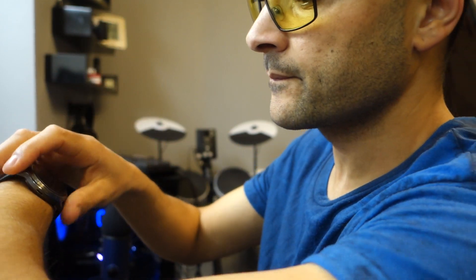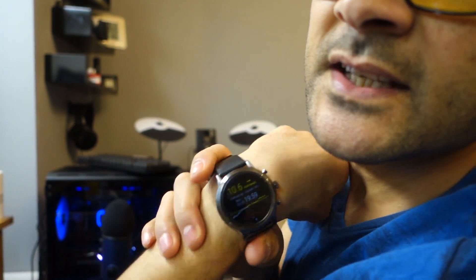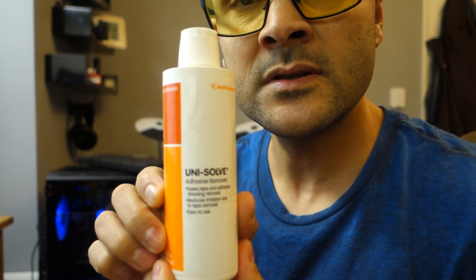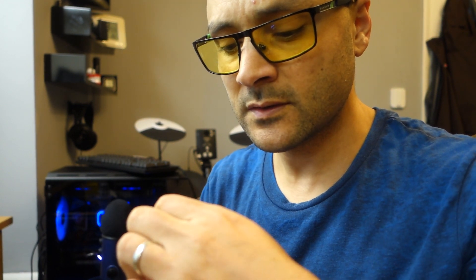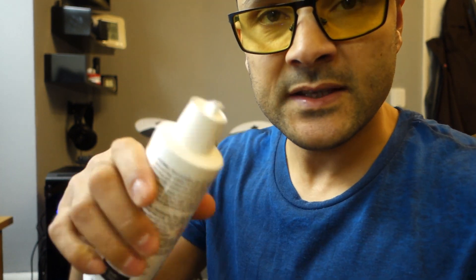I've got it showing all the time — it dims out but it's always on. So that's basically how you insert a new sensor. To remove the old one, I use this Unisolve, it's on Amazon. I just pour a little bit on the old tape, give it a few seconds, and it just comes off so easily. Then you just wipe that old place.